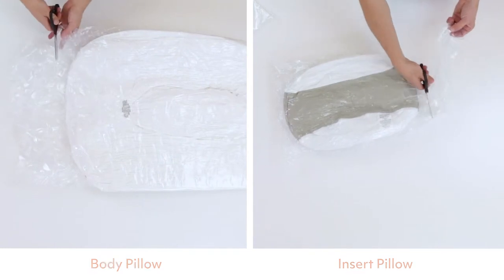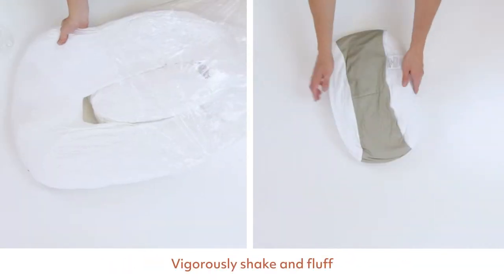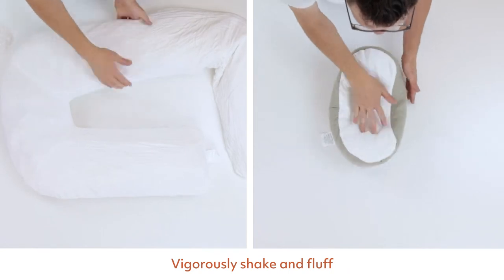Because the body pillow and insert pillow have been compressed quite tightly, they need to be vigorously shaken and fluffed to free the stuffing. Any new foam smell is normal, harmless, and will dissipate after a few days.